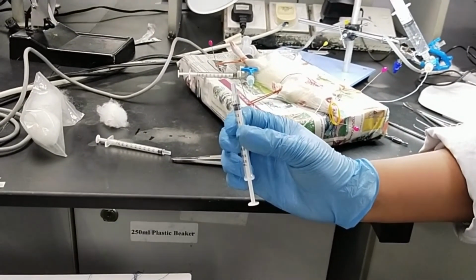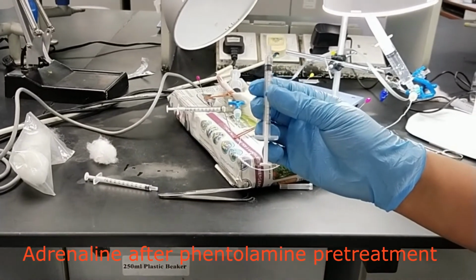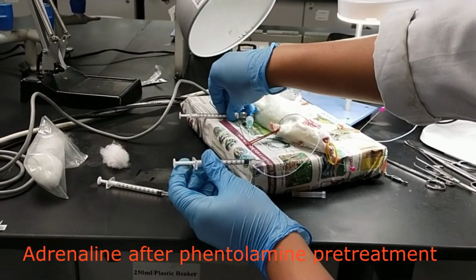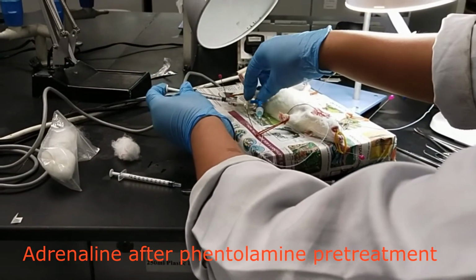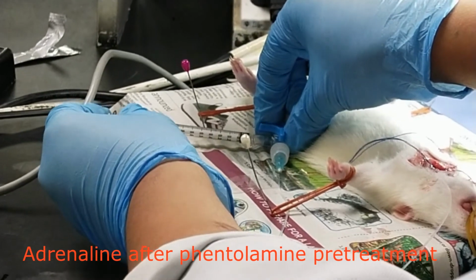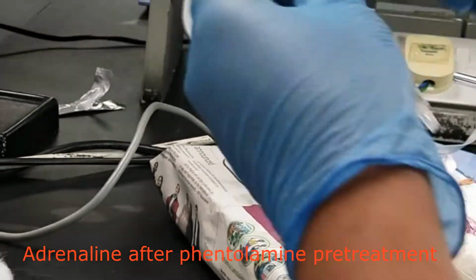So now we're going to proceed with the adrenaline. So we are using the concentration for the adrenaline is 0.5 microgram per ml, and the dosage for the injection is 0.3 microgram per kg. And we're going to see the effect of adrenaline after the pre-treatment by using the phentolamine. Okay, so first we're going to inject the adrenaline into the system, and then the same thing followed by 0.5 ml of normal saline.